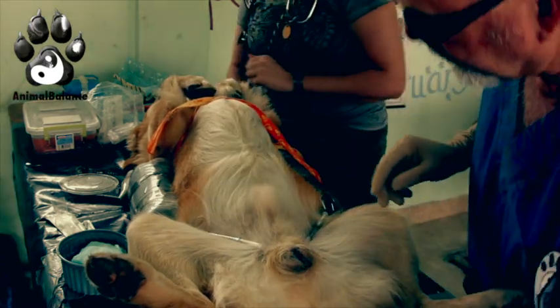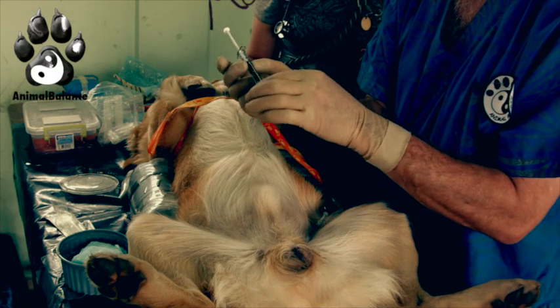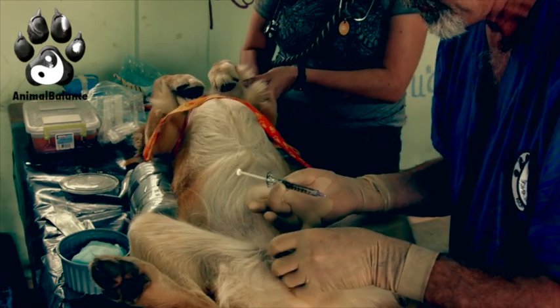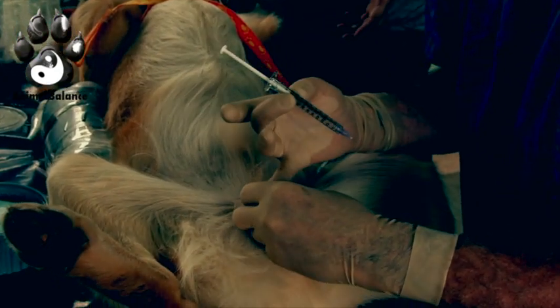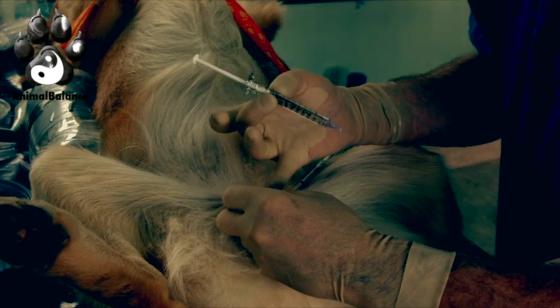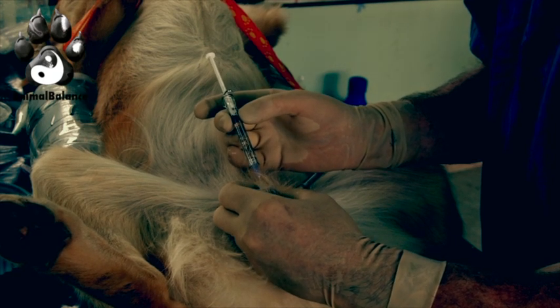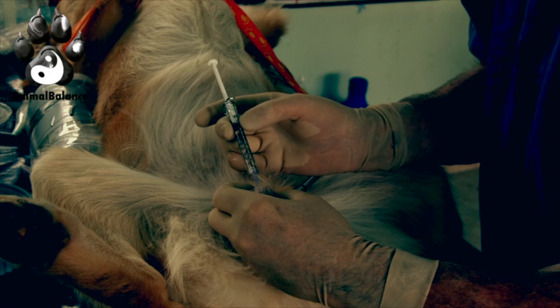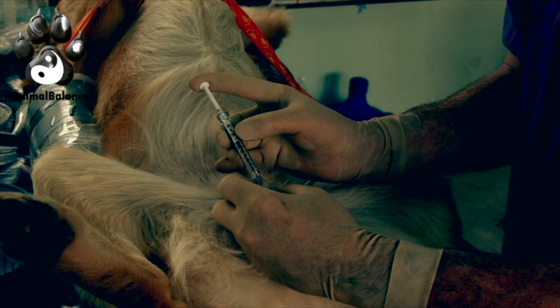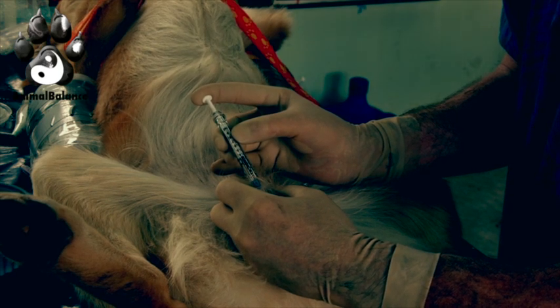When I do this procedure I hold the syringe like a dart, then gently bring the testicle up into the scrotum. There's a specific anatomical landmark I'm looking for — I never come in randomly from the backside. I come in from the cranial aspect and feel for the head of the epididymis. Palpating right there, I find my injection site and commence the injection into the center of the testicle, gently pushing down on the plunger.